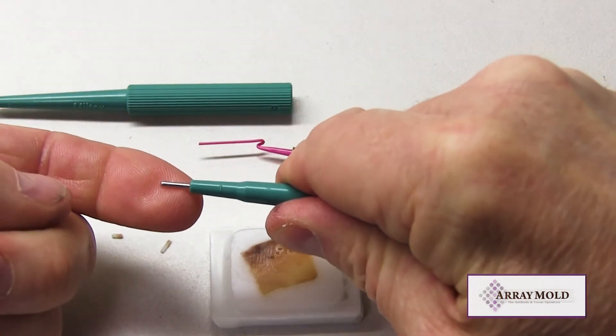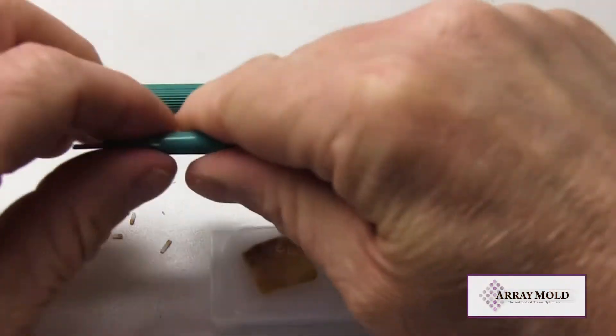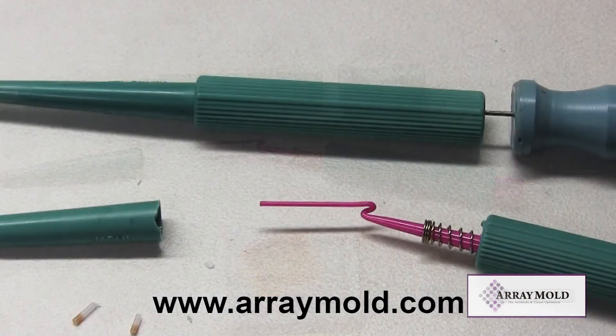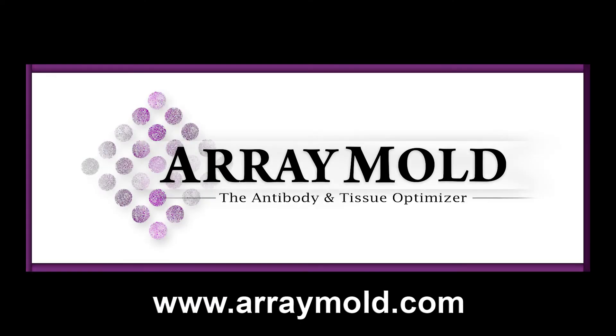These needles are also slightly different in size, so they are not interchangeable. You can only use that specific needle with the TMA instrument it was designed for. Please visit our website at arraymold.com to watch more instructional videos on tissue microarray construction. Thank you.